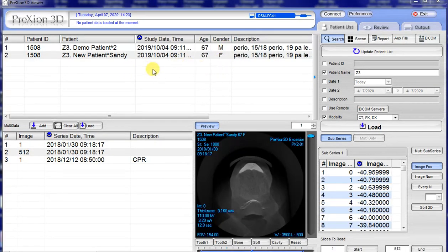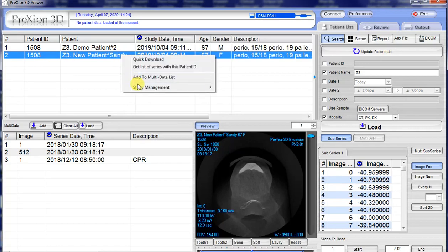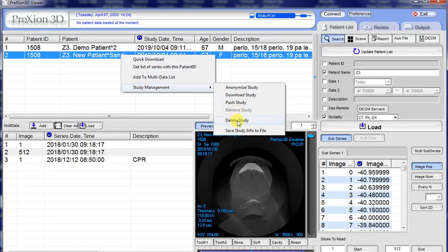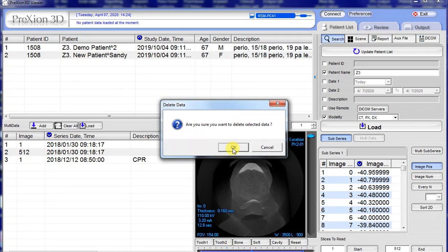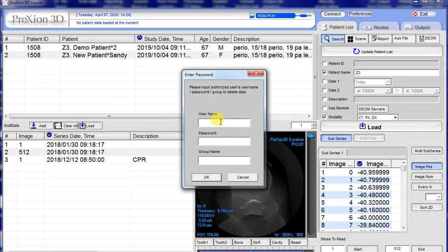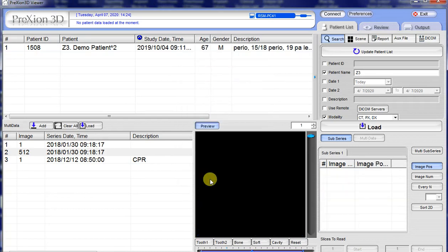If you're deleting a study from the first session after you log out and log back in, it's going to prompt you for a password. Let's do the steps again: highlight, right-click, Study Management, go to Delete Study. It's going to ask if you want to select the data, so you say yes. For the username, type 'scan' — lowercase just like that. Password is the very same word: 'scan.' Make sure you don't have caps lock on. Leave the group name blank. Click OK and there goes your study — it is deleted.